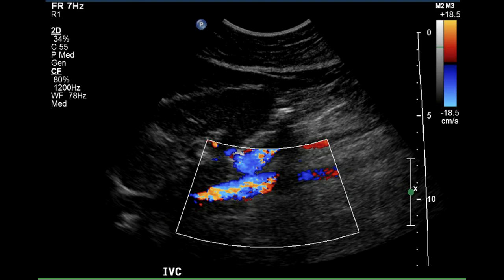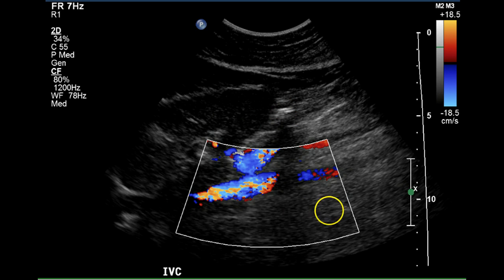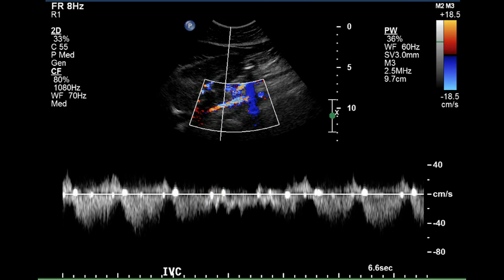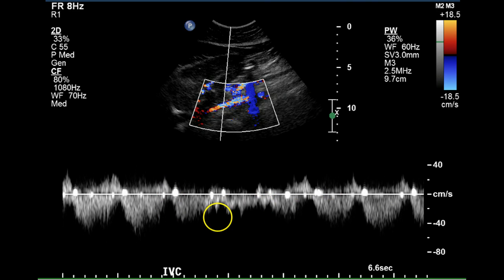The vena cava fills with color; there is a shadow from a gas bubble in the bowel. This is a normal vena cava pattern, with an atrial kick and some respiratory phasing, which is normal for the inferior vena cava in the upper abdomen.